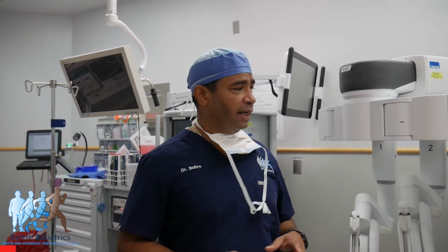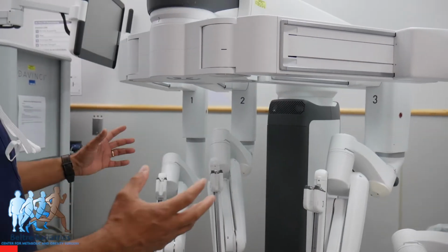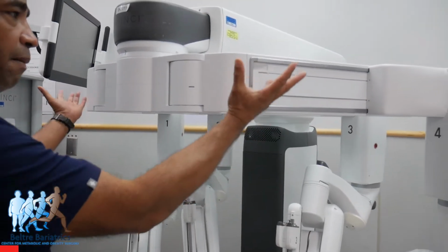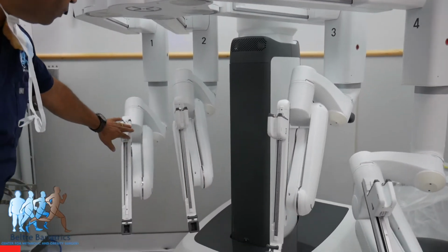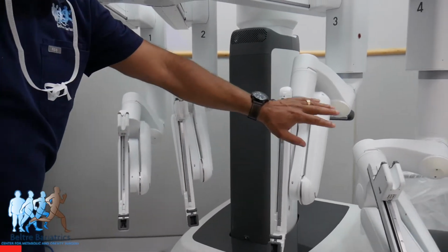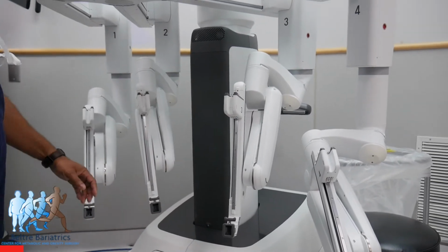The robot that we're using today is the Da Vinci robot, the Xi, which is the latest robot. And here is the robot pretty much. The robot is on a boom. This boom goes up, right? And these are the arms of the robot. It has four: one, two, three, and four. And this is the instrument bay where we put the instruments.